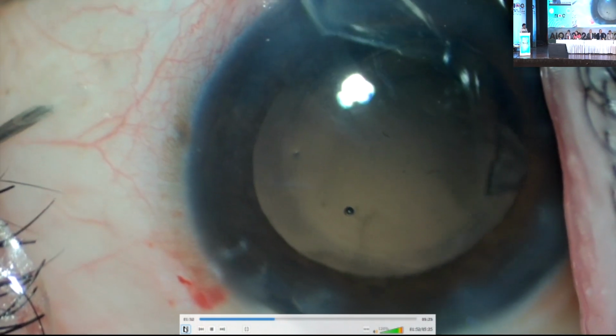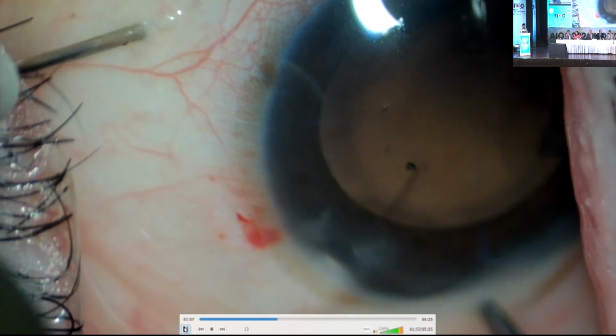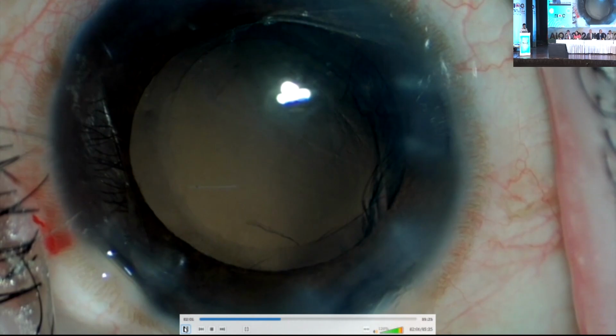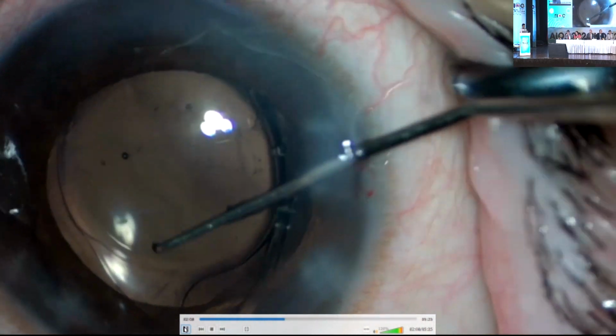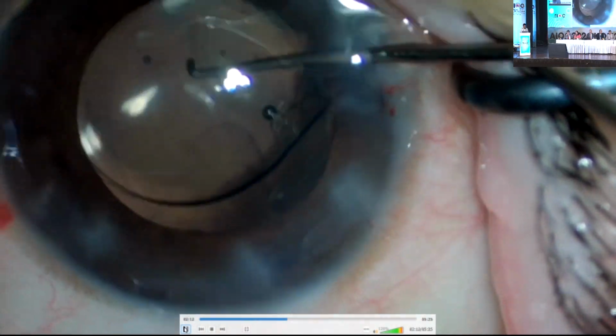I completed the case by taking the vitreous tap with a 26 gauge needle in the inferior nasal quadrant. As soon as I took the tap, the AC was well formed, and it was possible for me to place the one-piece IOL in the bag. Many times these situations have also happened with me. I would like to share one more example.